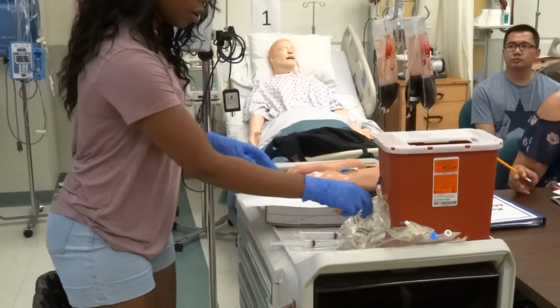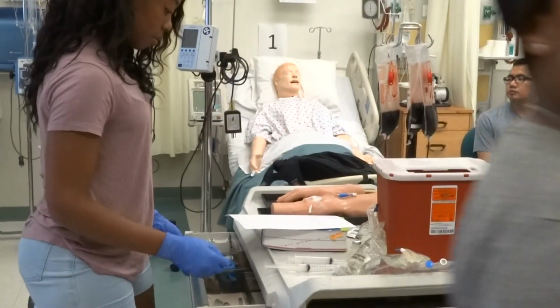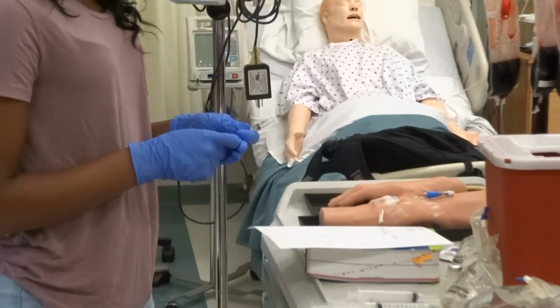It's fine. No, I'm kidding. Okay. It's good. Cool. Yeah. Okay, I'm just going to put Lasix in here. I know it's kind of hard.